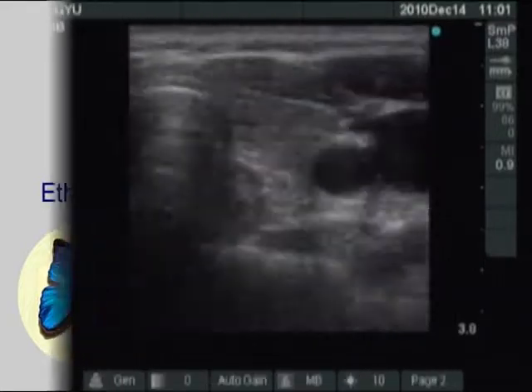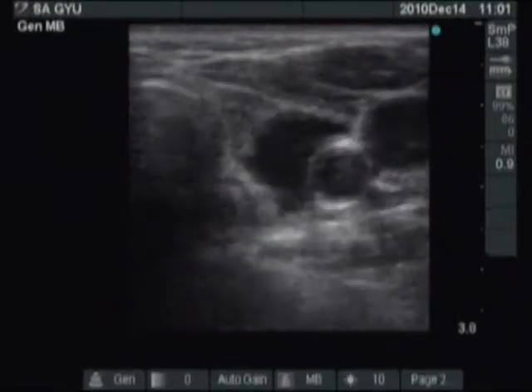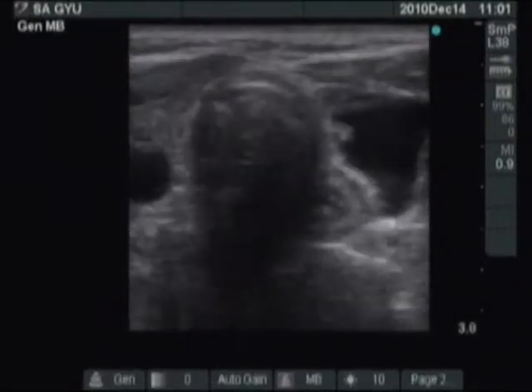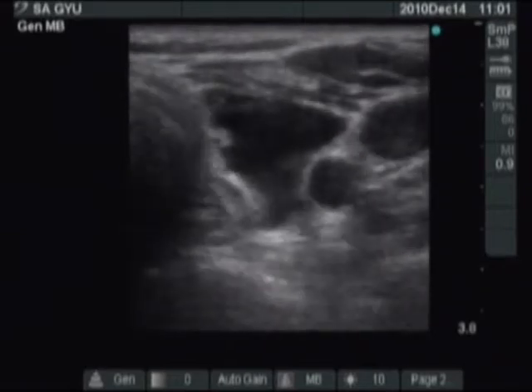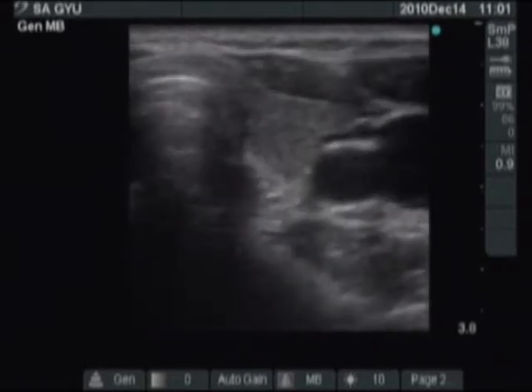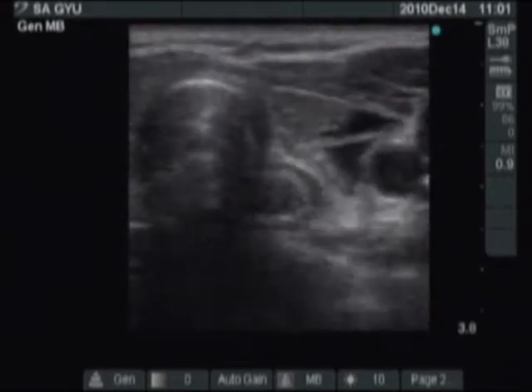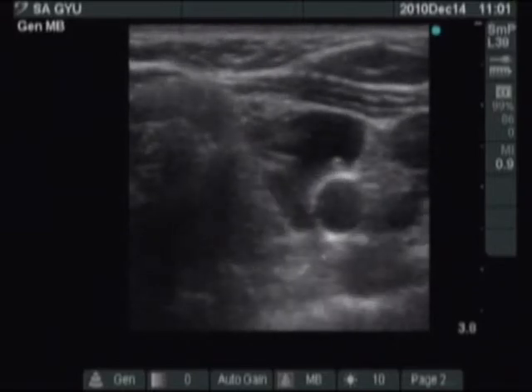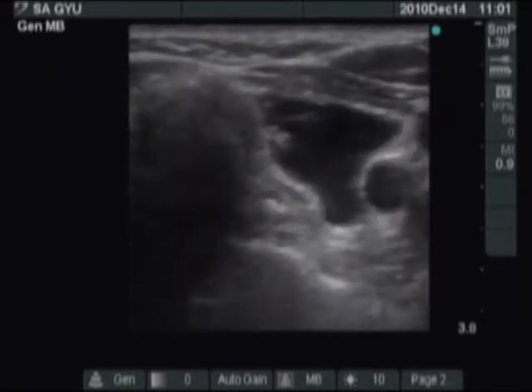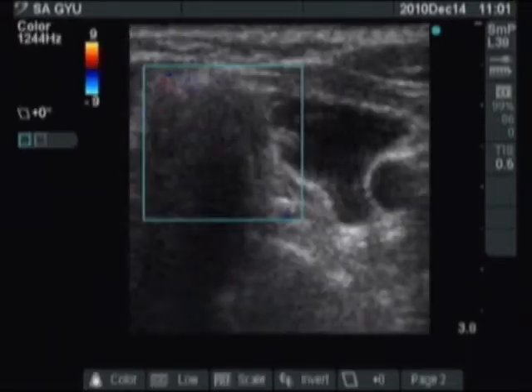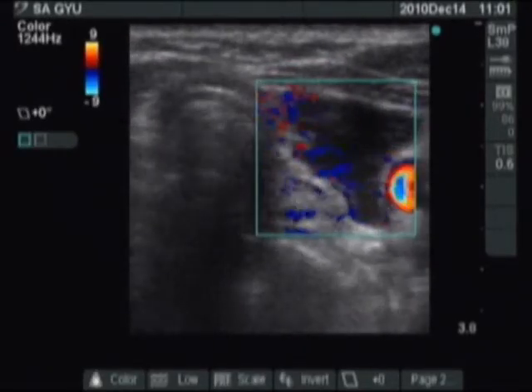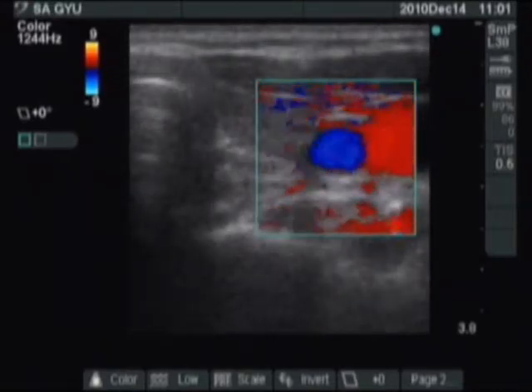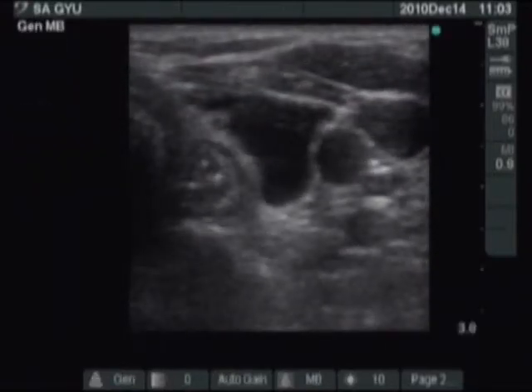We demonstrate the first session of sclerotherapy of a parathyroid cyst. The left lower parathyroid was cystically degenerated. The lesion was found beneath and dorsal to the lower pole of the left lobe. The lesion was very close to the carotid artery, so we had to be very careful during the procedure.